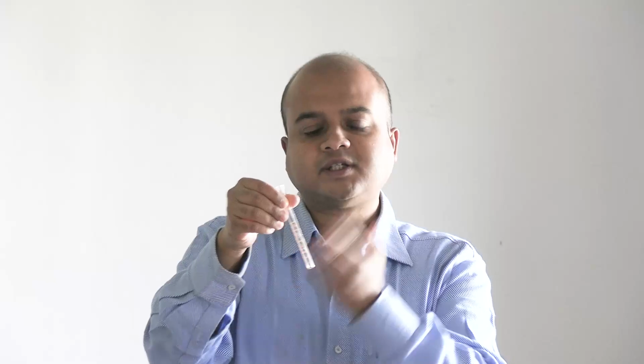The red ones are 20, 40, 60, 80, 100 like this, the percentage of hemoglobin. 100% corresponds to 15 gram percent. The graduations are given like that, but that is just because the manufacturer is still manufacturing like this. We do not need that. The method we use does not need the percentage graduation. You can just remember that 100% is equivalent to 15, but we need the yellow graduations.